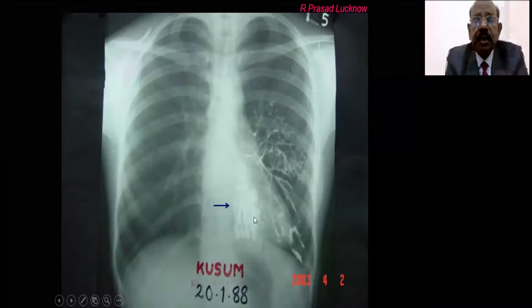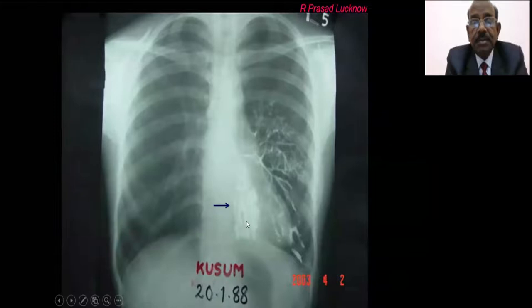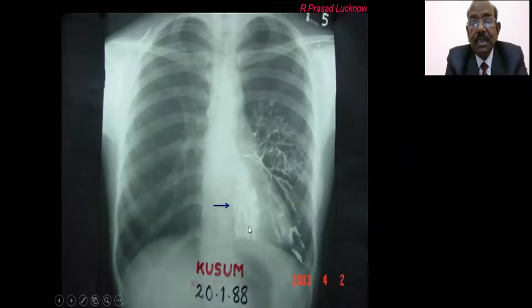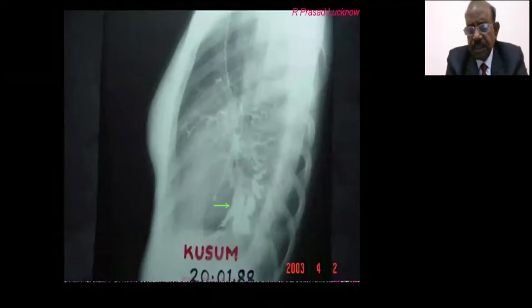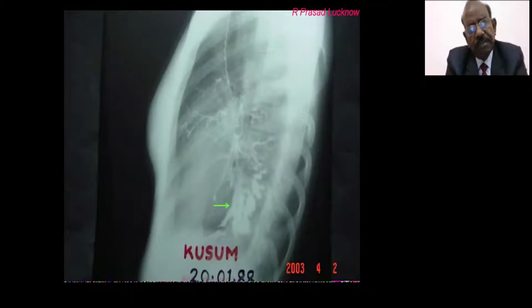A bronchography was performed. In those days bronchography was done — I was an assistant professor in KGMC in 1988. You can see the dilated bronchi have come closer, showing evidence of bronchiectasis and collapse. The upper lobe bronchus is quite normal. The dye came into the upper lobe bronchus beautifully. You can see the dilated left lower lobe bronchus with evidence of collapse. She had massive hemoptysis and I advised that without surgery it was not manageable. Since the disease was localized and she had life-threatening symptoms, she underwent left lower lobe lobectomy and I know she is still okay.